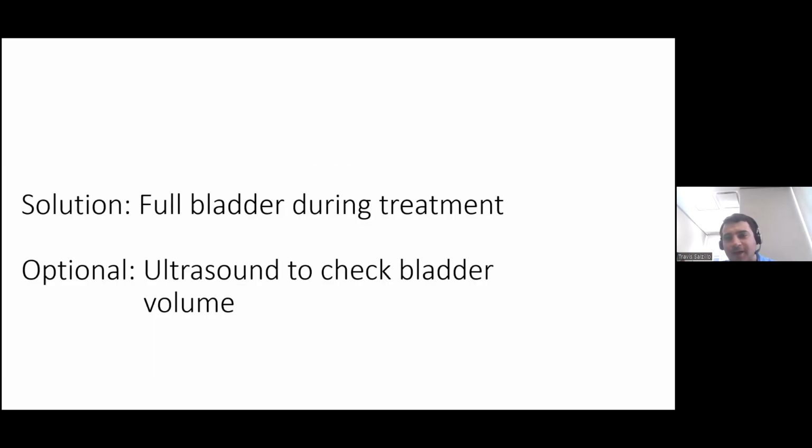And so the biggest thing we ask people to do here at MD Anderson is you have a comfortably full bladder before you actually get on the table. So for a lot of prostate patients, the physicians will notate we need a bladder filling of X, and usually that's the amount of bladder filling they had during simulation.